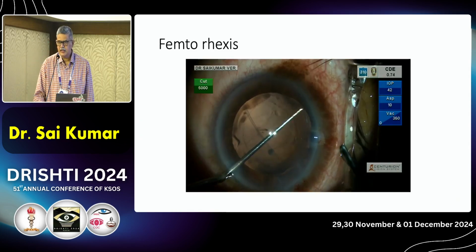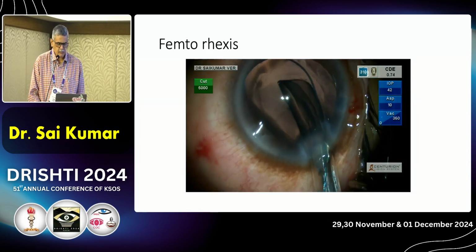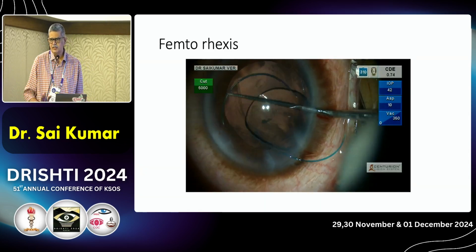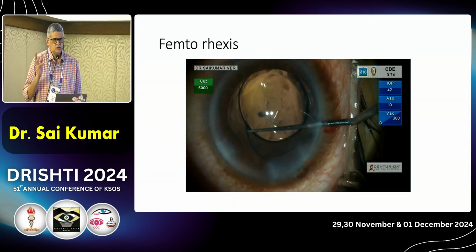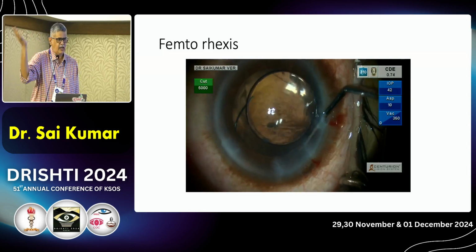There was some vitreous in the anterior chamber, small strands of vitreous. So I'm doing a limited vitrectomy. And like Minu told, in all these situations, always have a 3-piece lens backup. There are surgeons, you might have seen videos, where you see that there is a linear rent, the rest of the capsule is normal.